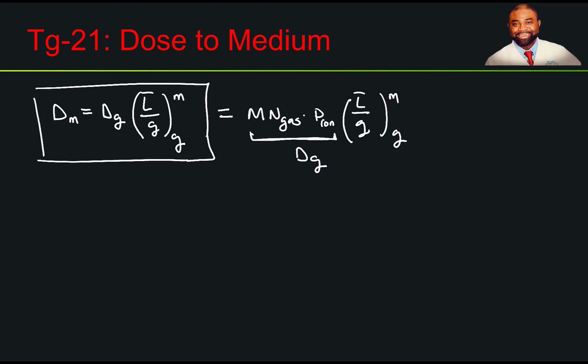But for a real ion chamber, the electron fluence is perturbed or disturbed by the presence of the ion chamber. Keep that in mind. The presence of the chamber perturbs the electron fluence, and this introduces some effects that must be taken into consideration. As a result, we will add a couple of correction factors to take that into consideration.